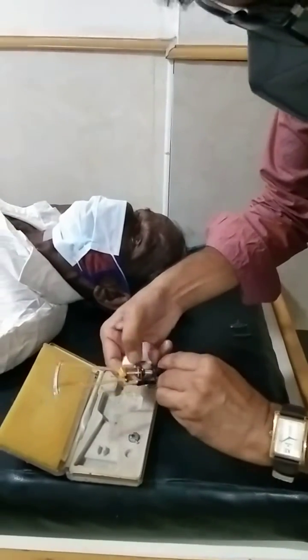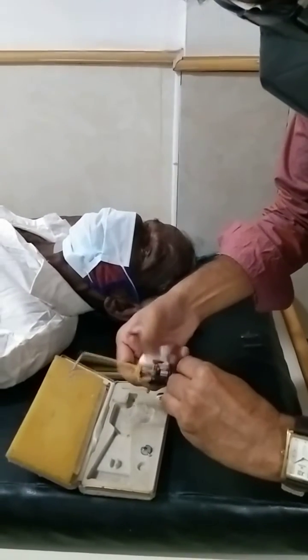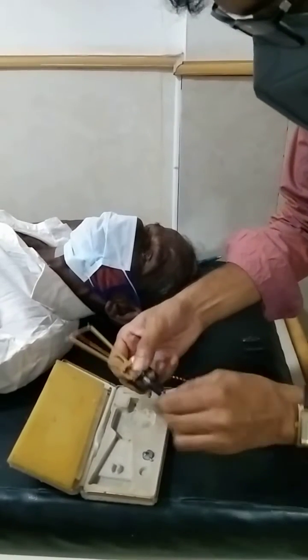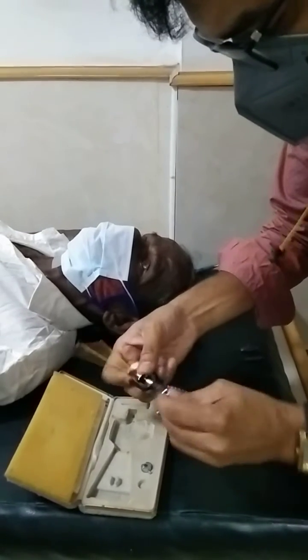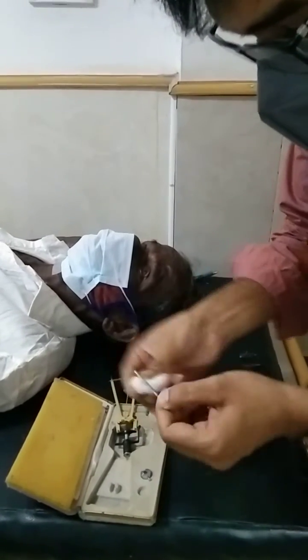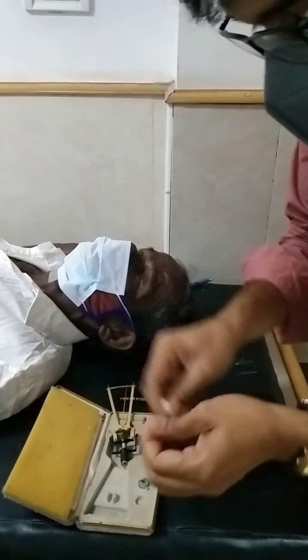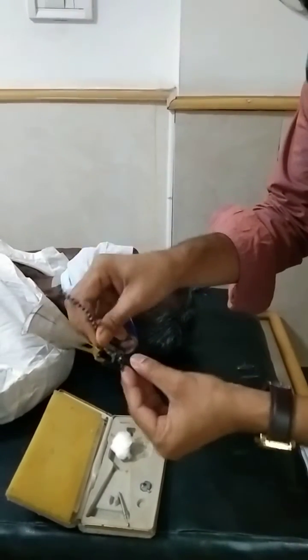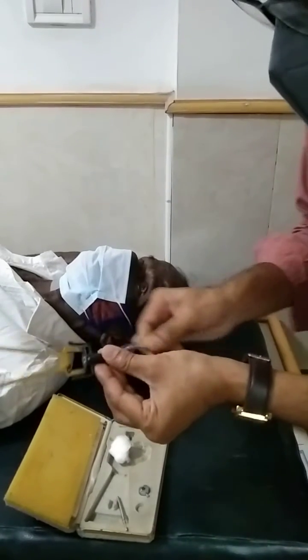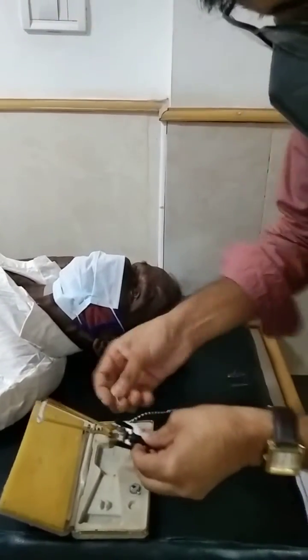First we need to remove this weight of 5.5 grams. After removing, we have to clean here with normal cotton so whatever deposits are there, it will go up. Second thing, we have to insert this swabbing rod here and then we have to clean 2-3 times, and after that we remove so this area will get cleaned, and again we have to tie this.